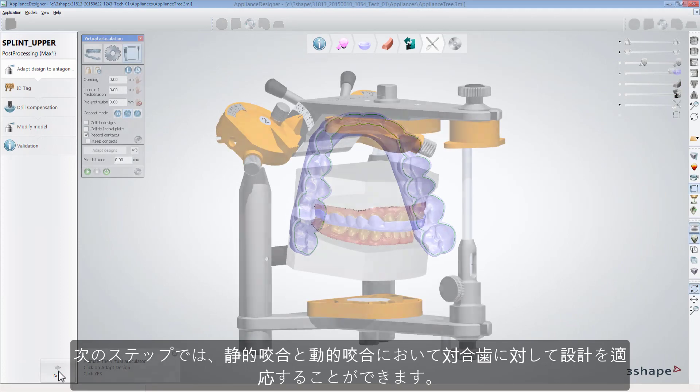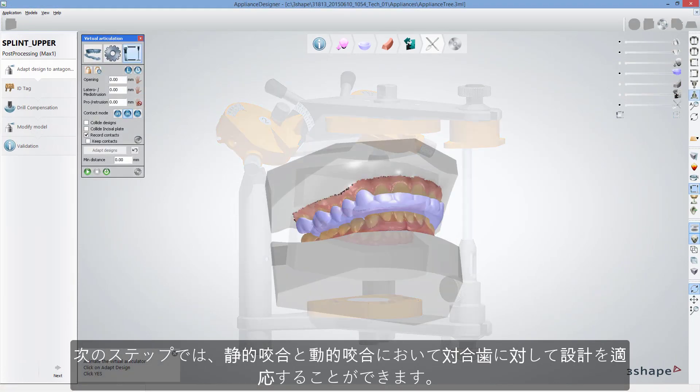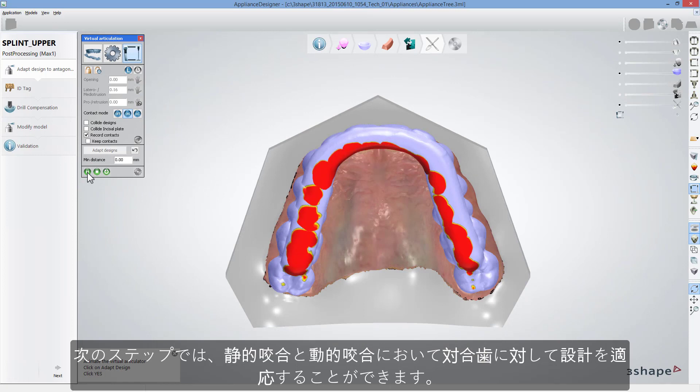The following step allows you to adapt the design to antagonist, both in static and dynamic occlusion.